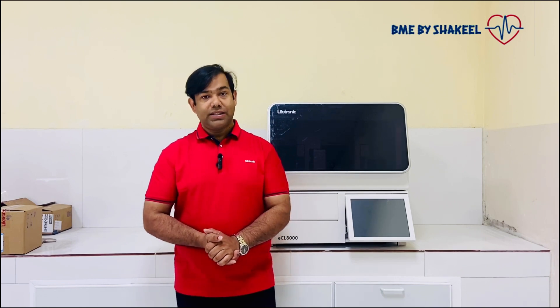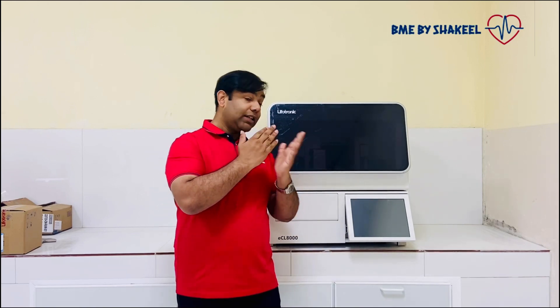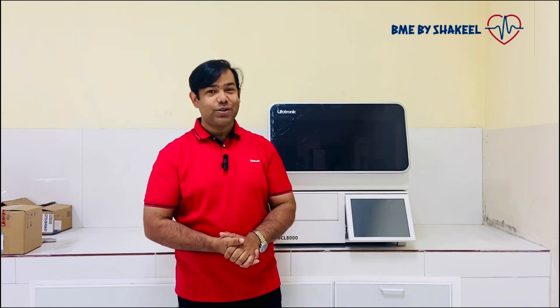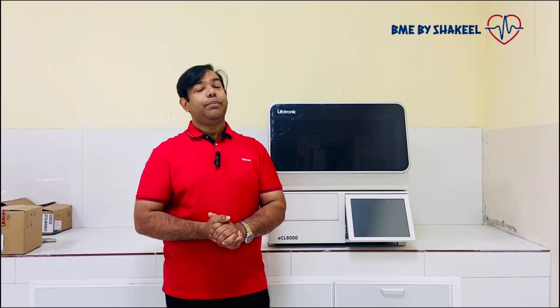Let's start today's video. In this video you will see how to do installation, how to load the reagents, how to run the patient samples, and some more things. Maybe I will show you how to run the patient sample as well, and if I get time, I will show you how to do maintenance of this LIFO system.